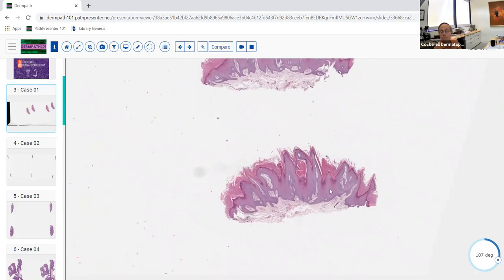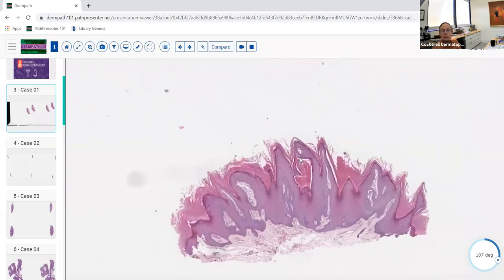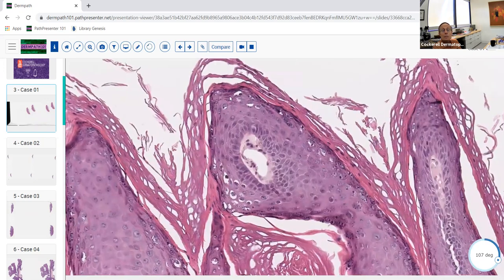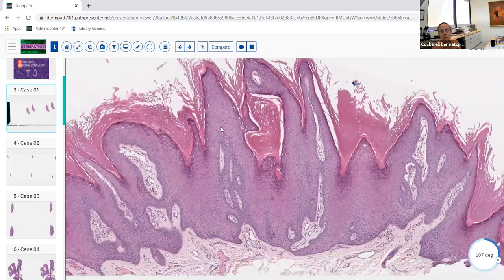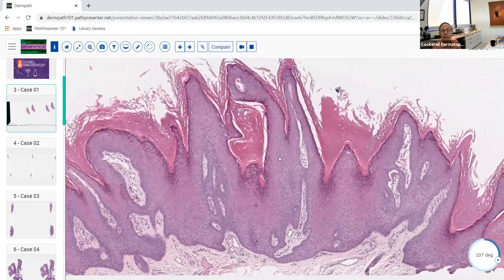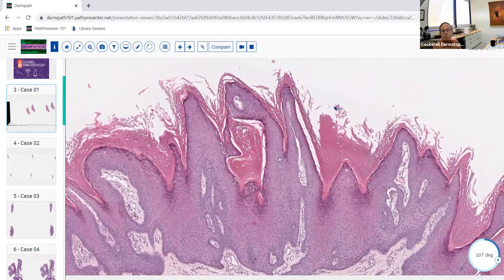Hopefully most of you, when you look at this, would say that's pretty classic for a wart. It's got verrucous epithelial hyperplasia, digitated epithelial hyperplasia, and even a few koilocytic cells here in the upper part of this papillated structure. So this is pretty classic for a wart. And the reason we show this — even most first-year residents would get this right — is that there are lots of human papillomavirus types that actually cause HPV infection.